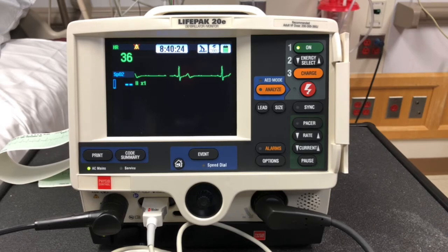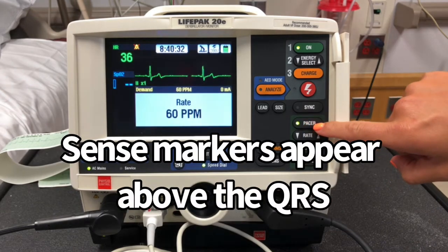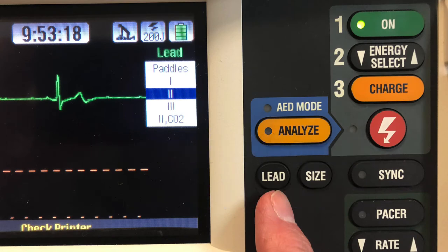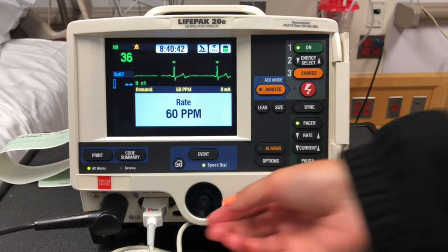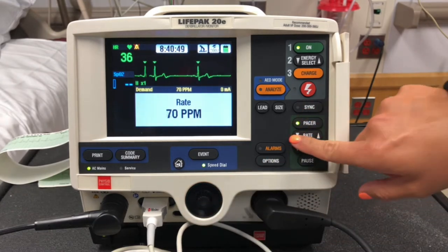The LifePak 20E can also be used to transcutaneously pace symptomatic bradycardia. Hit the pacer button; the rate increases in increments of 10, and the speed dial increases or decreases in increments of 5. For this, we're going to go to 80.